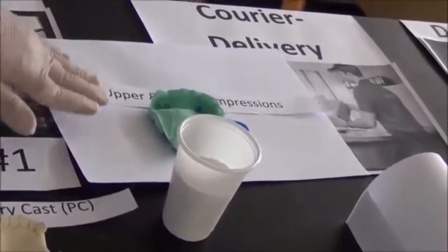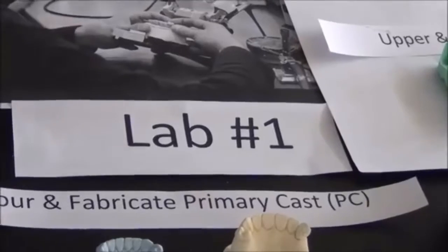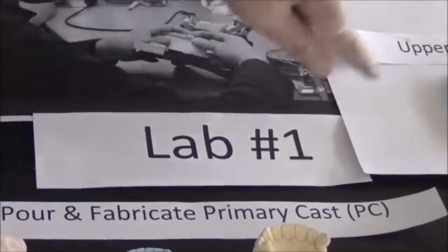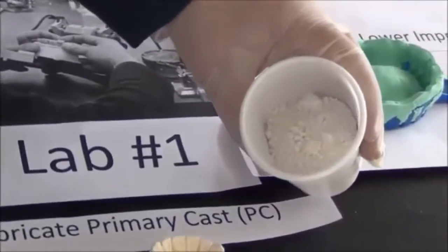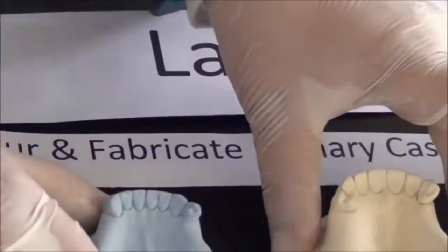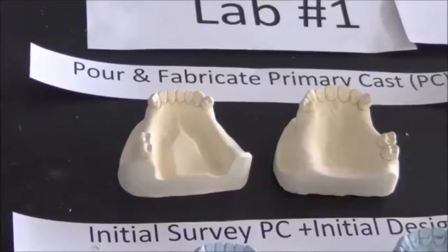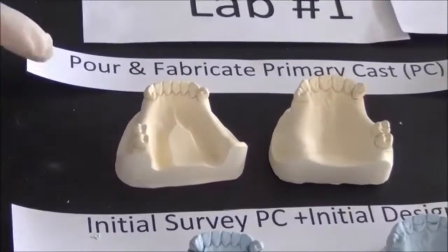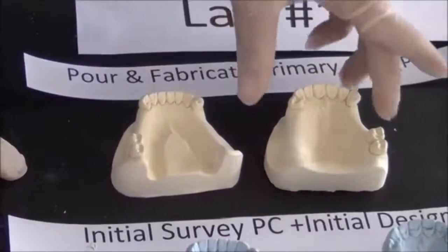So in the dental lab, the dental technician will receive this, disinfect it, if it was not disinfected in the clinic, then begin the pouring process. And I remind you that primary casts are poured using plaster. The pouring process will result in 2 casts, upper and lower primary casts. These primary casts will also be called study casts, because on them we study our design.